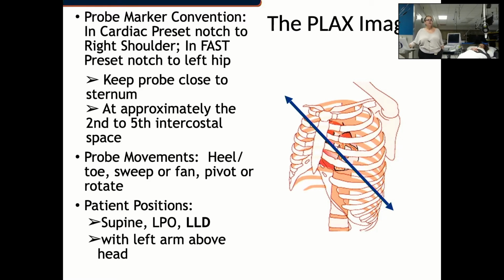And your patient position, supine, LPO, often the best position is LLD, and you want your patient to put their arm up over their head because it'll help stretch out your intercostal spaces and make your scanning window a little bit easier.